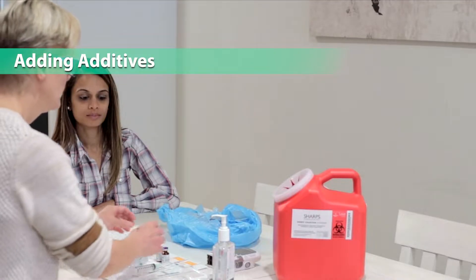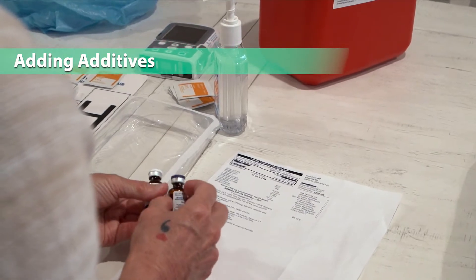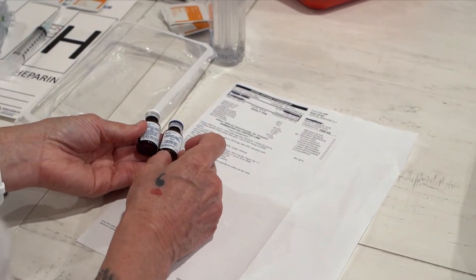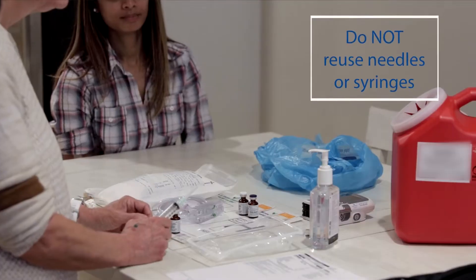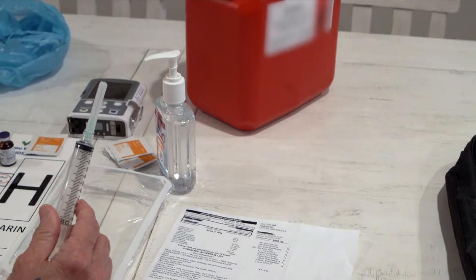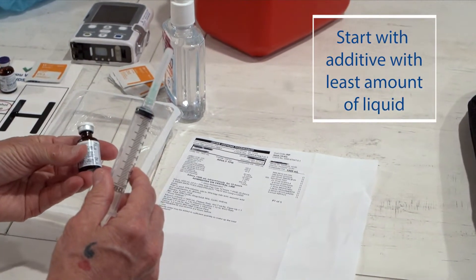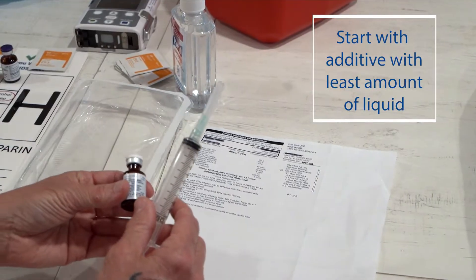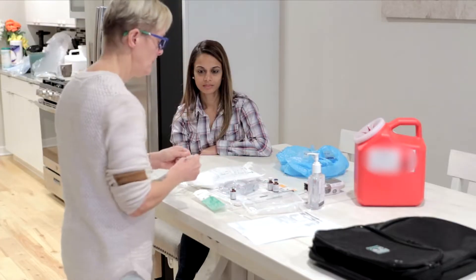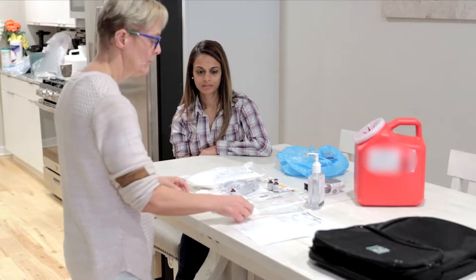You will now add the additives to the TPN. Double check your orders first by comparing the ordered medications to the provided labels. Be sure you have the right number of supplies. Remember, do not reuse needles or syringes — each additive will have a separate, one-time-use syringe and needle. Your orders will tell you how much additive to draw up with each syringe. Start with the additive with the least amount of liquid. Clean the top of the vial with a separate alcohol pad by swiping the pad across the top of the vial one time. Allow the vial to dry for 15 seconds.